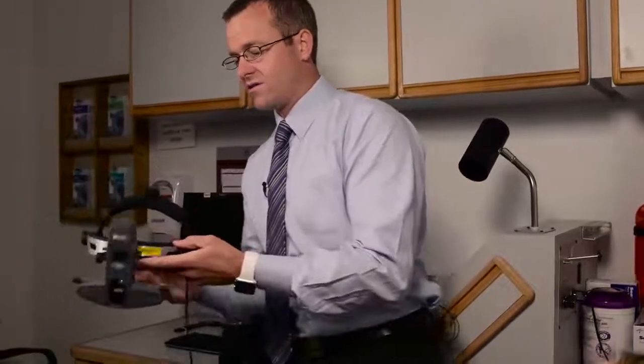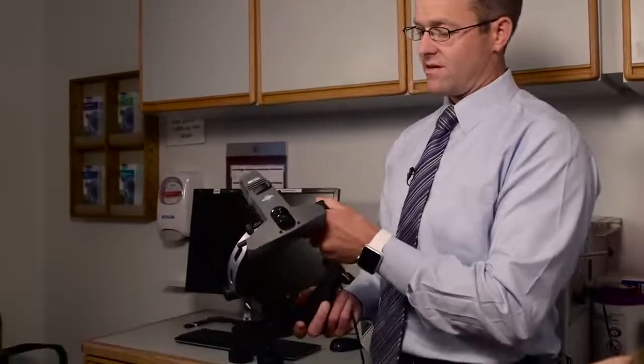All right, so we have completed our slit lamp exam and our posterior segment exam using the 78 and the 90 diopter lens. And now that we've looked at the posterior segment, the nerve, the blood vessels, the macula, the mid-periphery, we're going to try to look out farther into the retina, so more out in the periphery of the retinal exam. And in order to be able to do this, we commonly use some different tools.